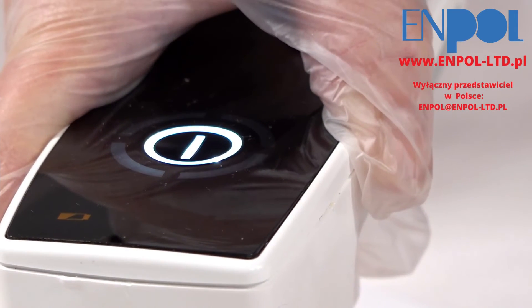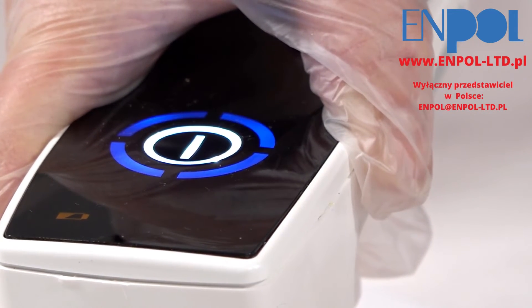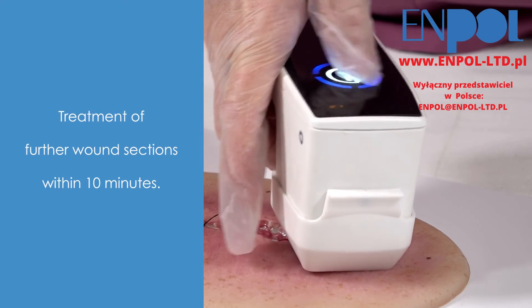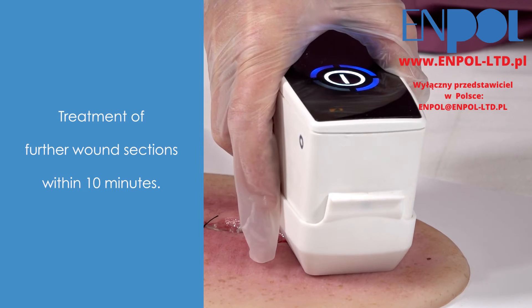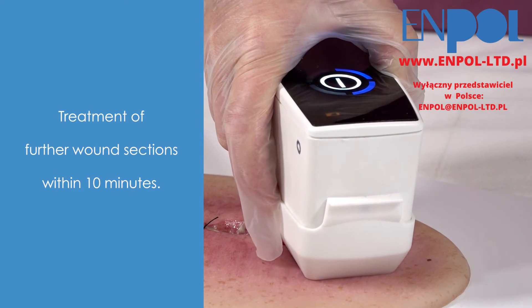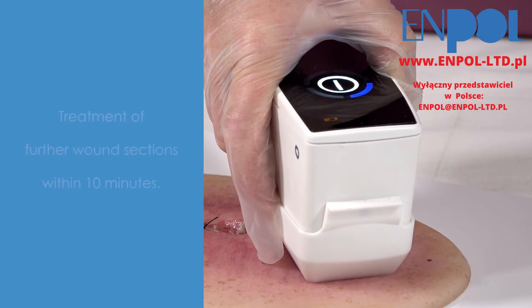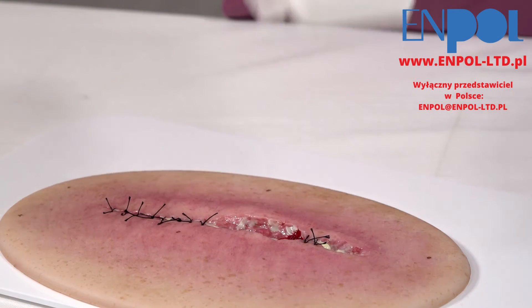One spacer allows you to perform a total of 6 treatments over a 10-minute period. Please also watch our video on the operation and use of the PlasmaCare. The usual routine for changing a wound dressing can be maintained.